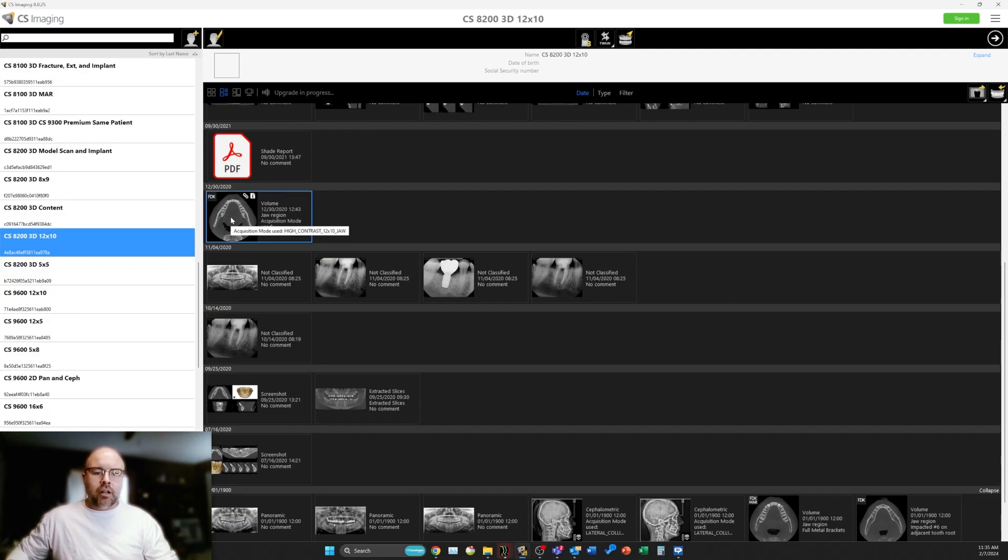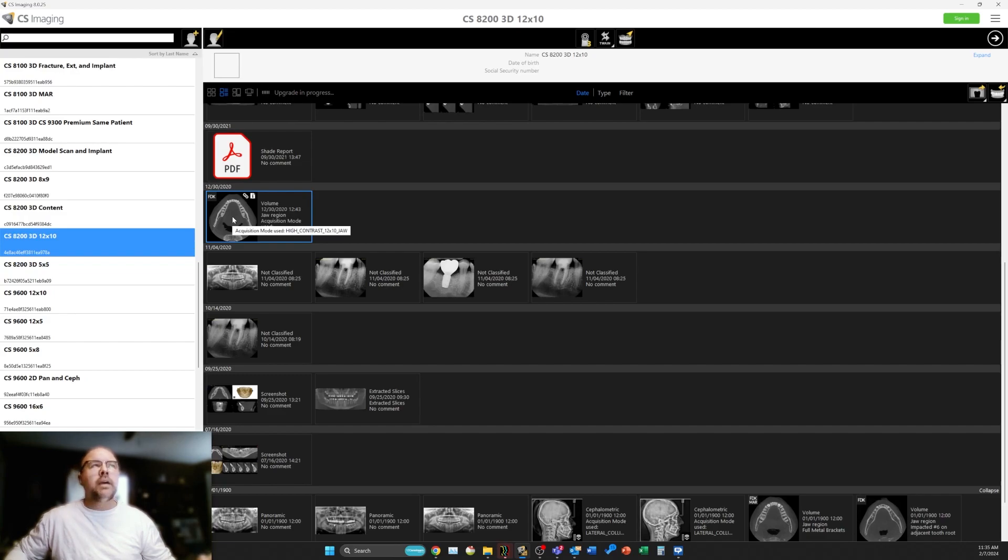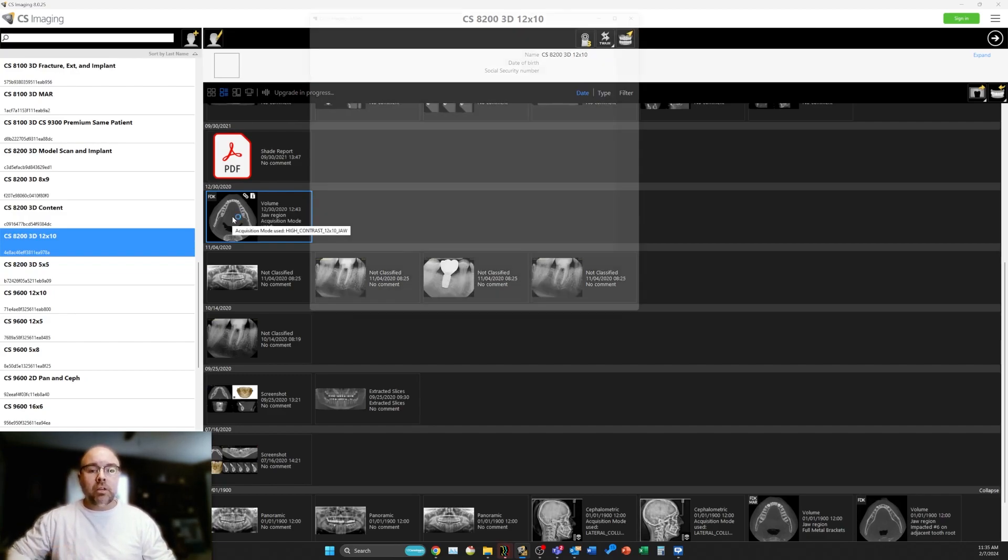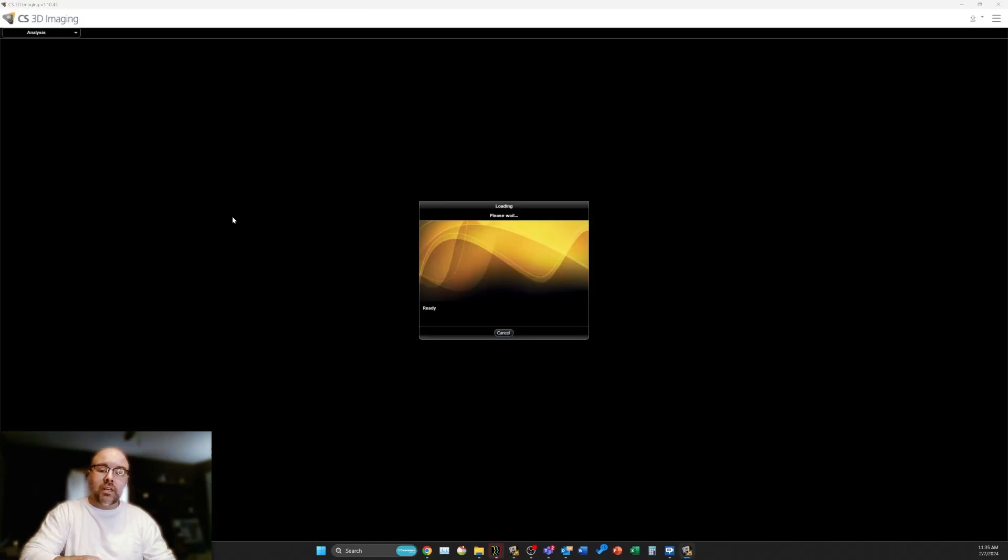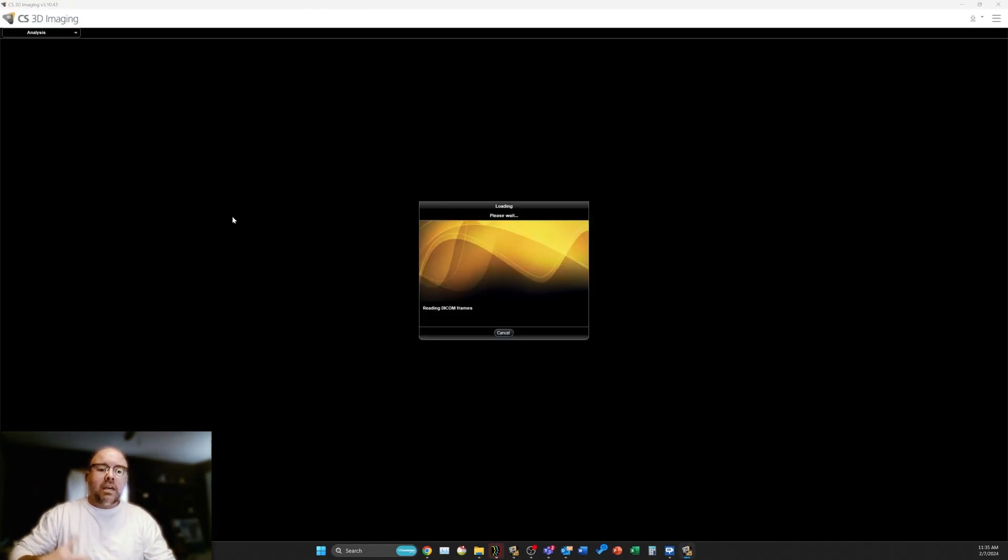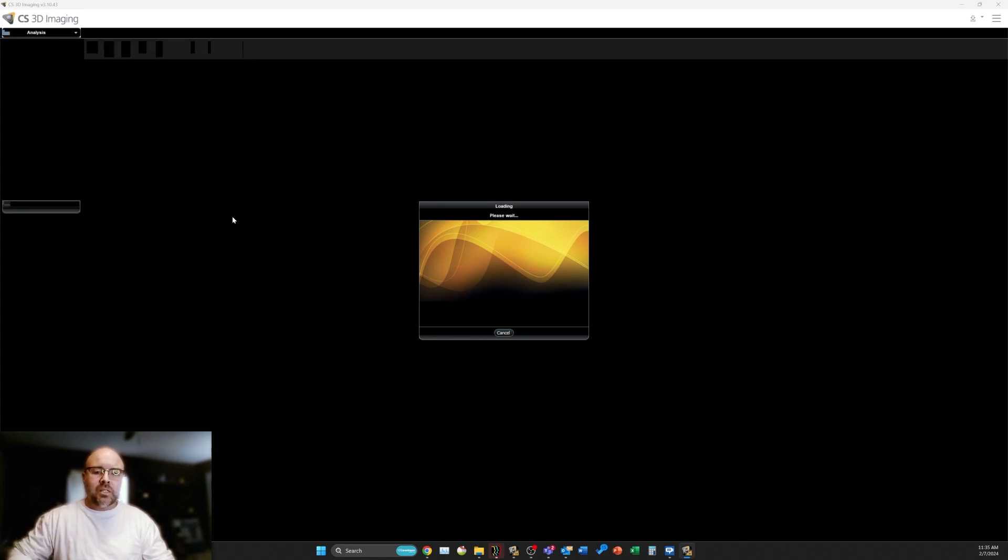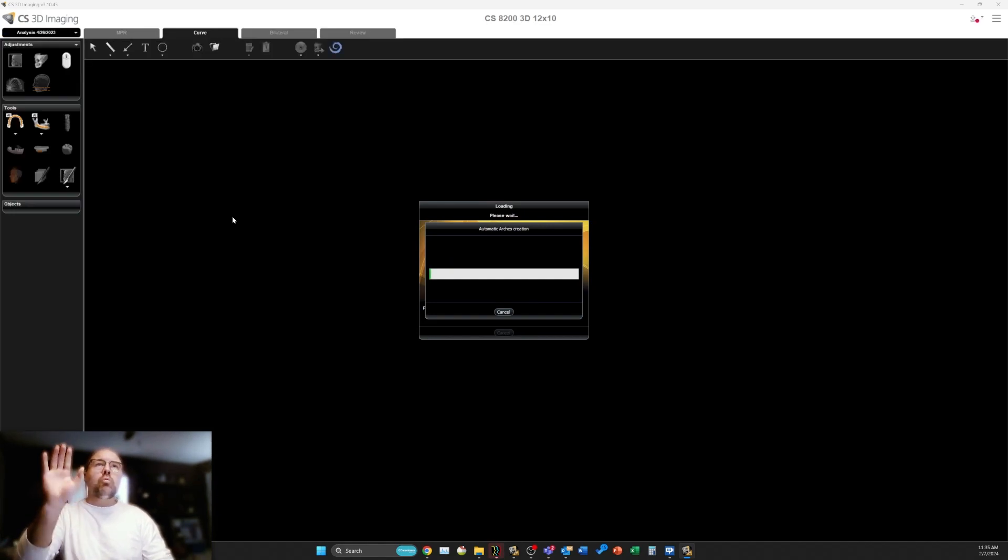Here we've got a scan on an adult female using the CS8200 3D Neo Edition CBCT. You're going to see everything in real time here. I'm going to open up this case. One of the things that you should experience with this and the previous version is about two times faster opening of these CBCT scans. This new software is optimized so well.